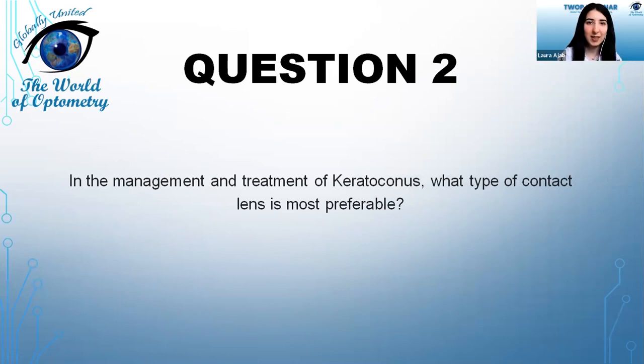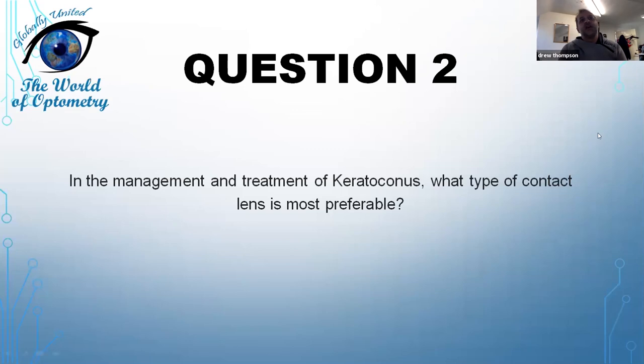All right. So question two: in the management and treatment of keratoconus, what type of contact lens is most preferred? In my particular practice, I am a big fan of the mini scleral lenses. They're much more comfortable than most because of their larger area. But I don't restrict it to any particular lens. I try and pick the best lens for the patient, but I do tend to fit more mini sclerals than anything else.